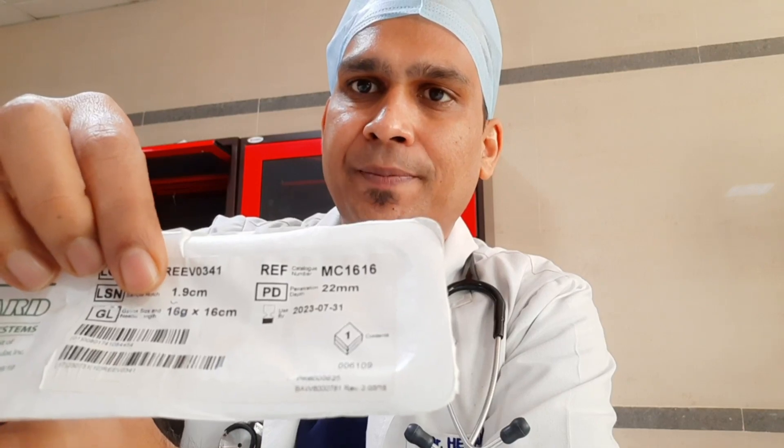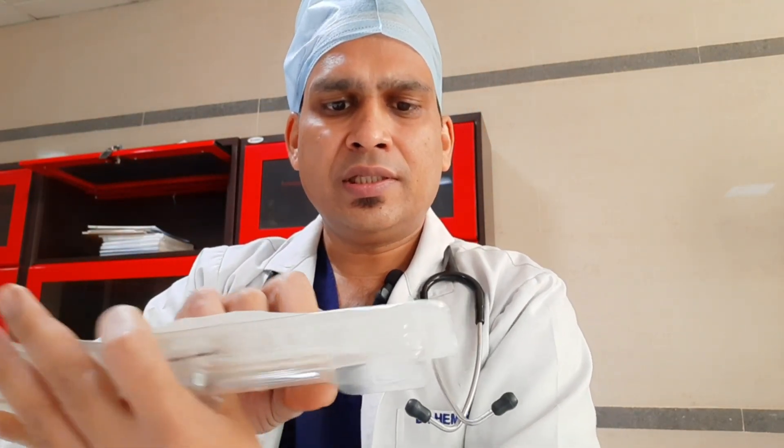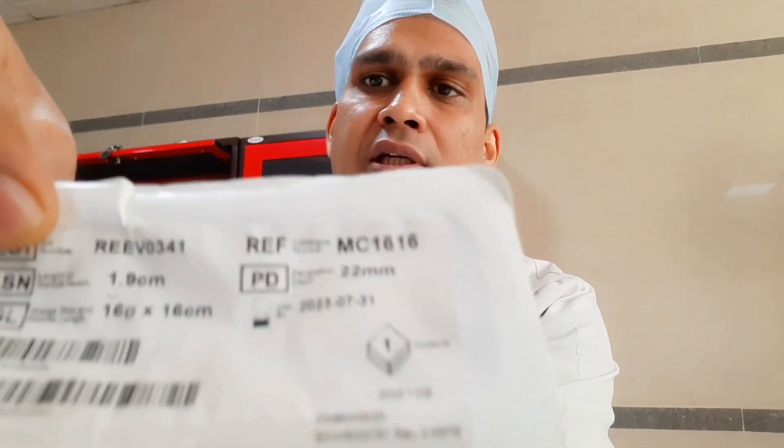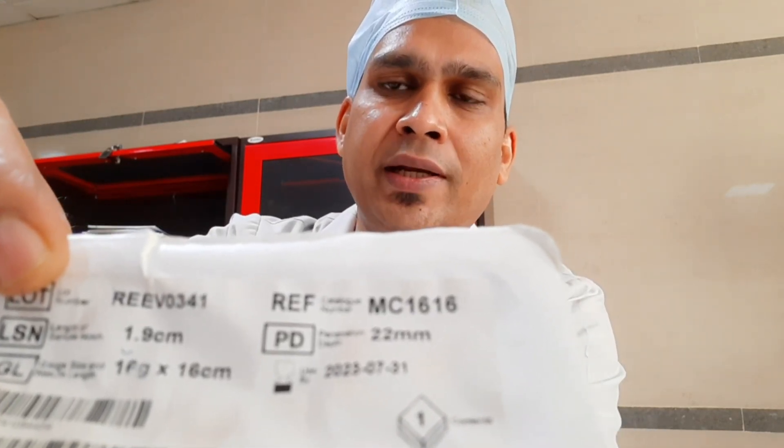One more thing you can see here is the depth of penetration: 22 mm. I'll tell you about that in detail. And one more thing you can see is the length of notch, which is 1.9 centimeters. I'll tell you detail about all these things. So we will open it.